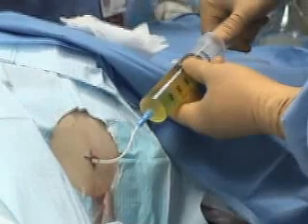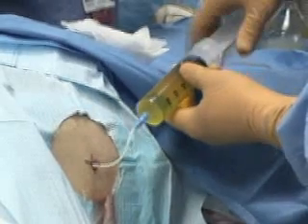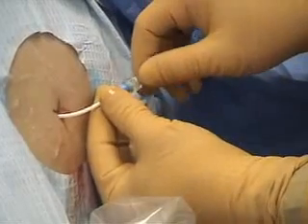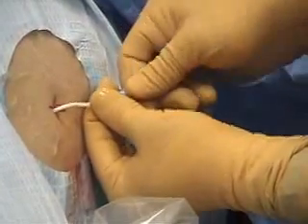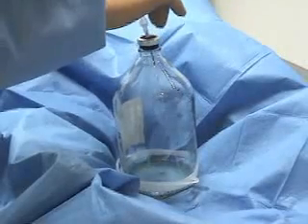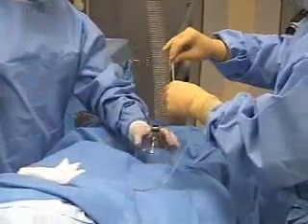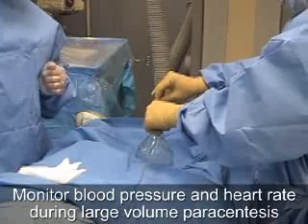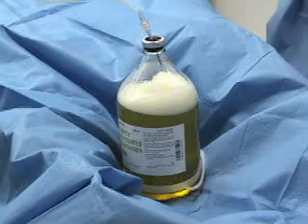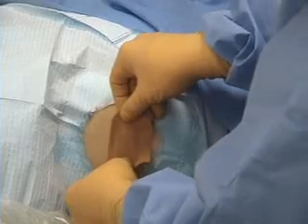If a diagnostic sample is required, attach a large syringe to the catheter and aspirate 30 to 60 milliliters of fluid for analysis. For therapeutic large volume paracentesis, attach the high-pressure tubing to the end of the catheter and then to an evacuated container. Further containers may be used for collection of fluid if necessary. Blood pressure and heart rate should be monitored during large volume paracentesis. Once the desired quantity of fluid has been removed, withdraw the catheter and apply a bandage.